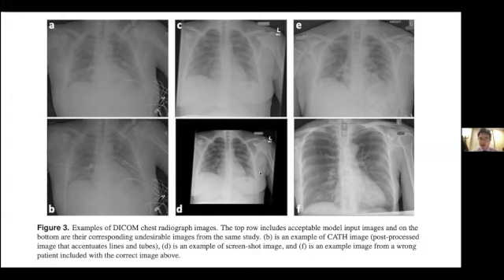You can have kind of strange cropping. Some patients will have multiple chest X-rays due to challenging patient positioning, which is actually very common, especially in sick patients who are in the ICU. And as a result, picking which series, and so each one of these different images in the context of radiology has a separate series, and to pick which one gets sent to the AI inference model is actually very challenging. And so we actually had to work very closely with the CCDS team to try to develop rule-based systems that use the DICOM metadata to help route the correct image.